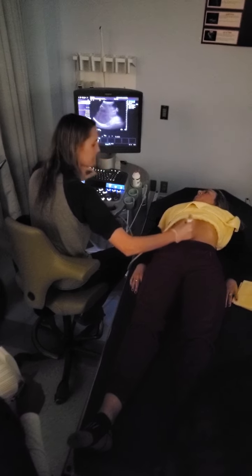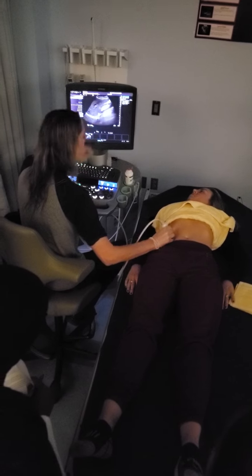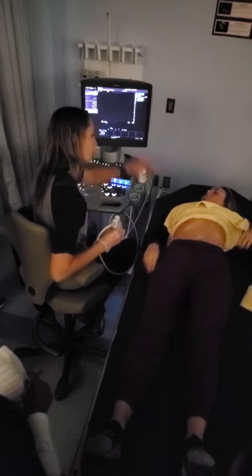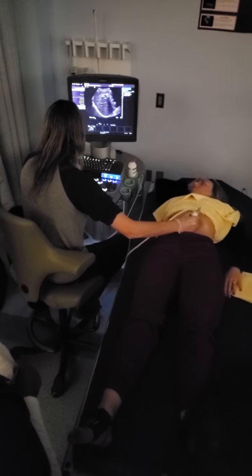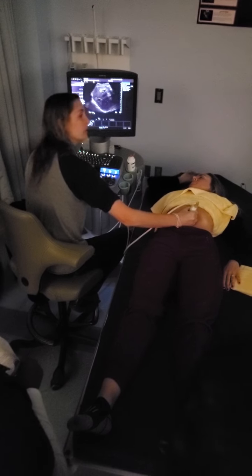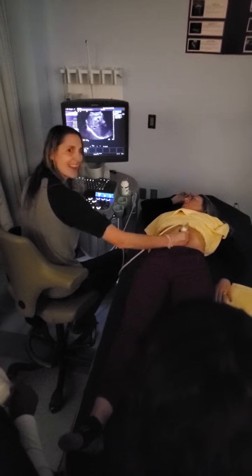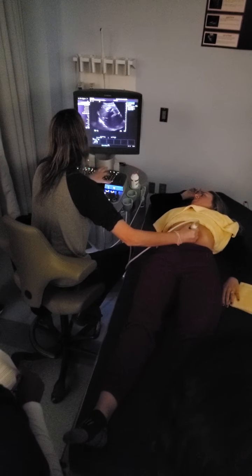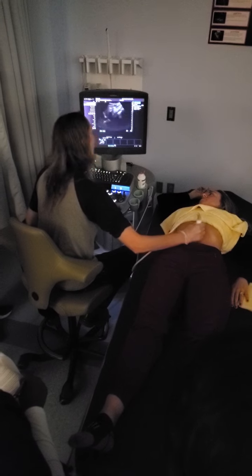And if we get bowel gas, we're going to move a little bit more laterally and posterior, and we can see that. Go ahead and breathe, and I'm actually going to have you take this out and put it right over here. That will just kind of stretch everything out. Okay, is everything correct? Annotation. Nice catch. Yep, my annotation is correct. So Sag, right. And when you're ready, big breath in.